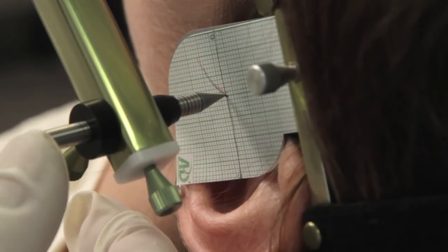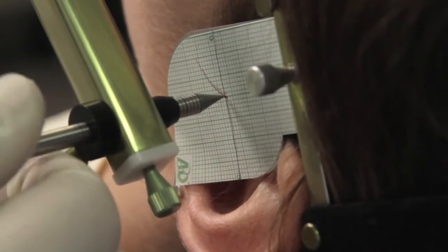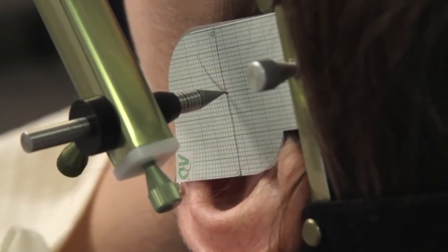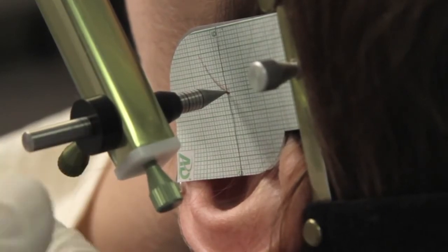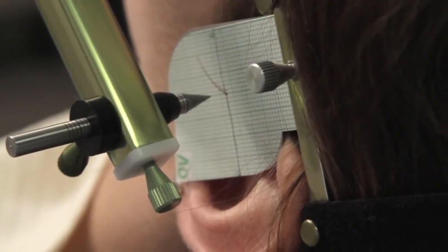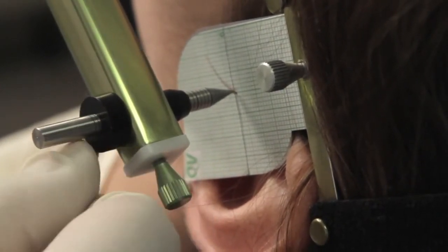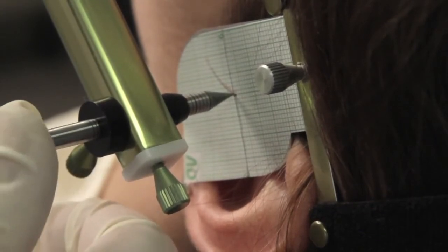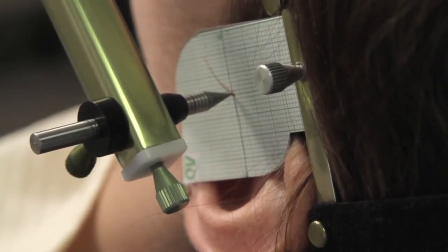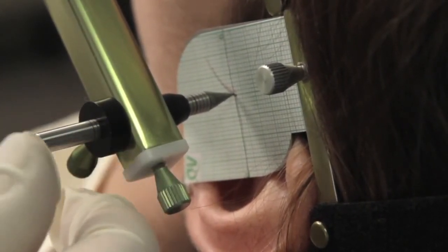I'll move the stylus pen in and touch the flag, and you can see there's approximately 1.5 millimeters of marks showing here. So when the patient moves to the right, that stylus will move out like this. That's an exaggeration, but it will move out. And so I will measure from 1.5 millimeters to wherever the pen moves. And I'm measuring in relation to the side of the bullet here. So when it's touching the flag, well, after a second look, as it's touching the flag, we're 2 millimeters from the edge of the bullet here with our millimeter marks.